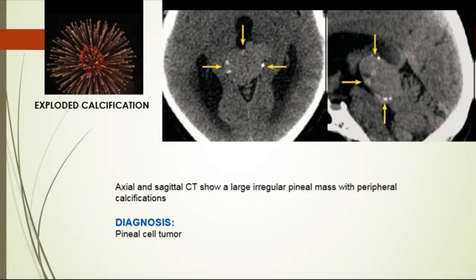Again, the differential diagnosis of the pineal region solid masses includes pineal parenchymal tumor, germ cell tumor, metastasis, glioma, lymphoma, neuroendocrine, meningioma, vascular lesions. I'm repeating it to keep it more in mind. Okay. The clinical symptoms include the Parinaud syndrome, which is the upward gaze palsy, like we said, headache, and ataxia. So we should look for the calcification in the pineal gland in the adults.